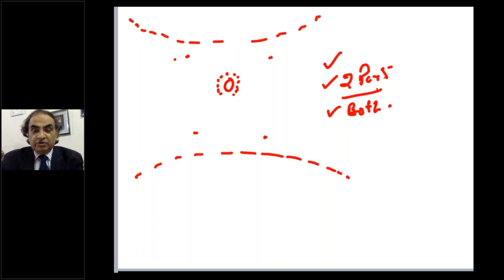Or if you're playing golf and the golf ball is lost. So both should be done by you. If you hand over the torch to your friend, then he is doing the search. You're not doing the search because he'll move it anywhere. So remember that. So both with the surgeon.